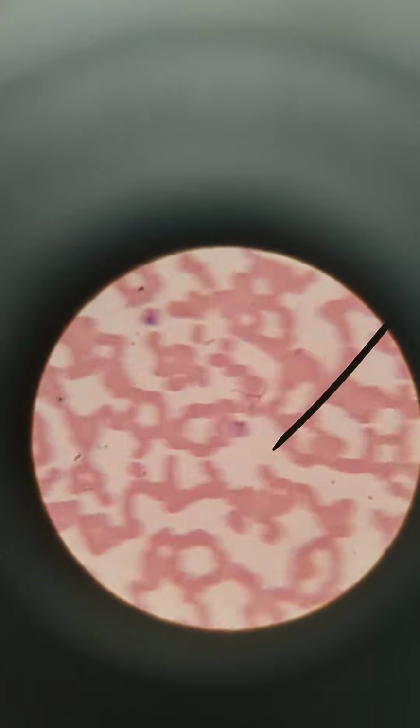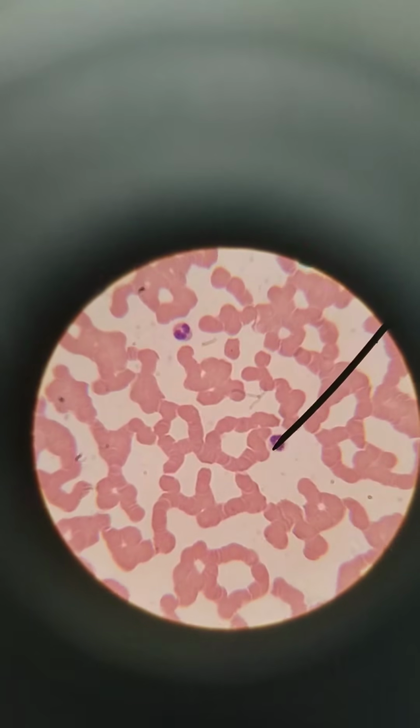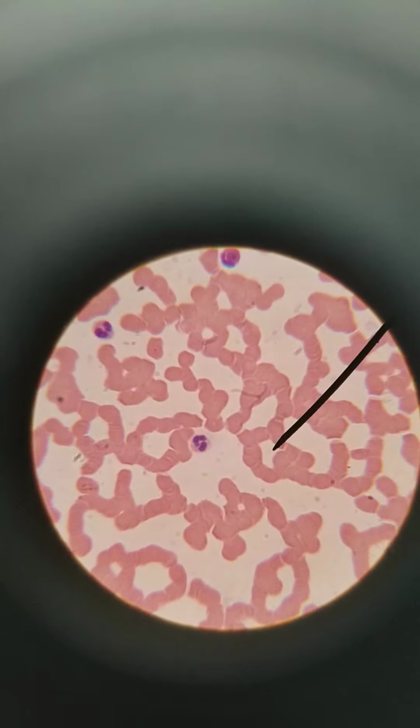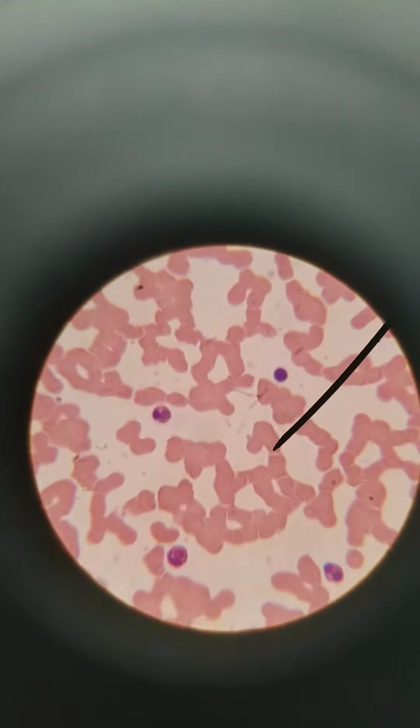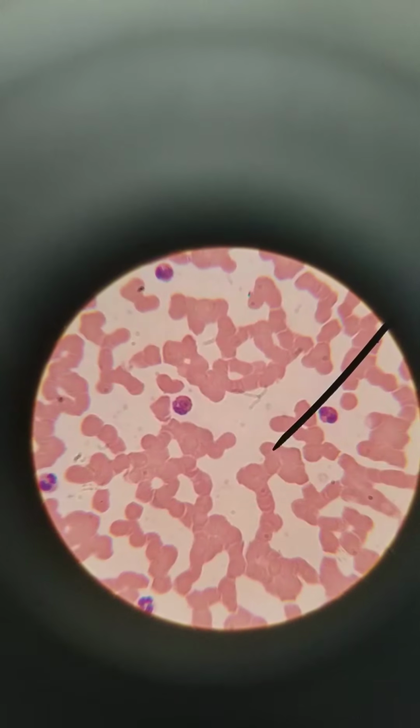Down here, of course, you can still have a bunch of neutrophils. See how many lobes this one has with lighter cytoplasm? That's still a neutrophil. I mean, you'll still have those, but this has a higher than normal amount of eosinophils.